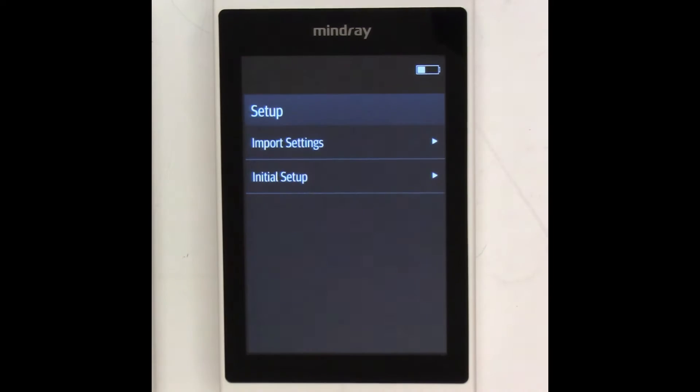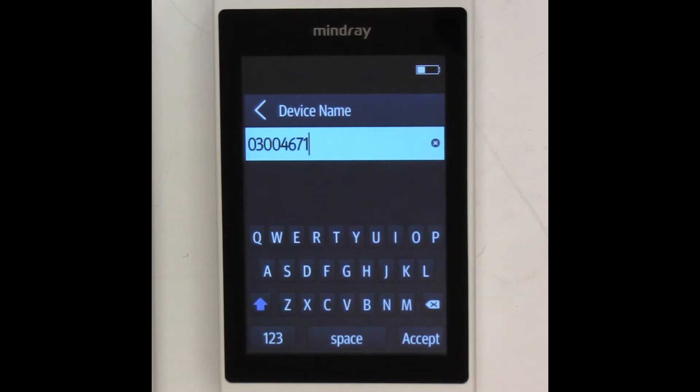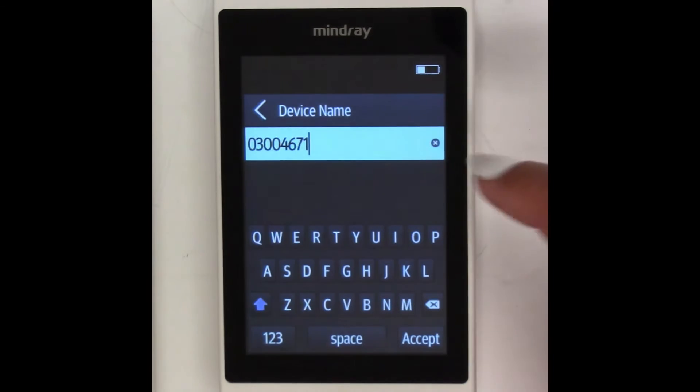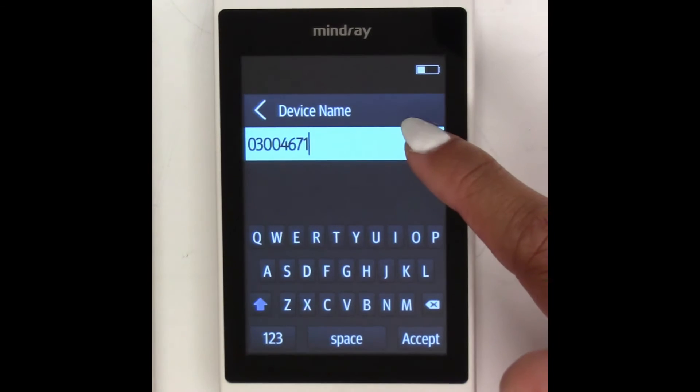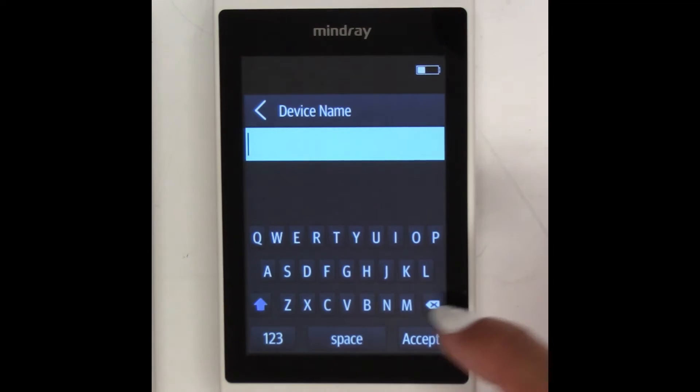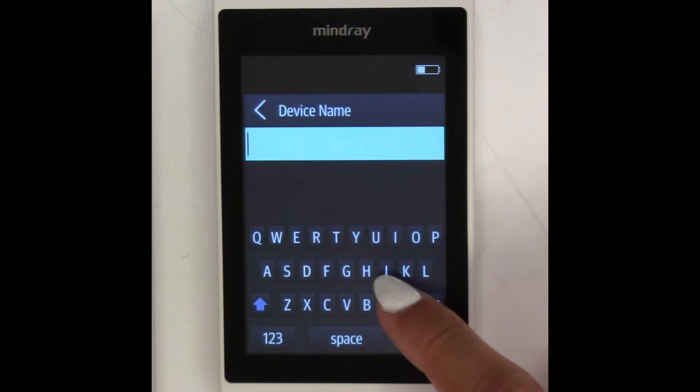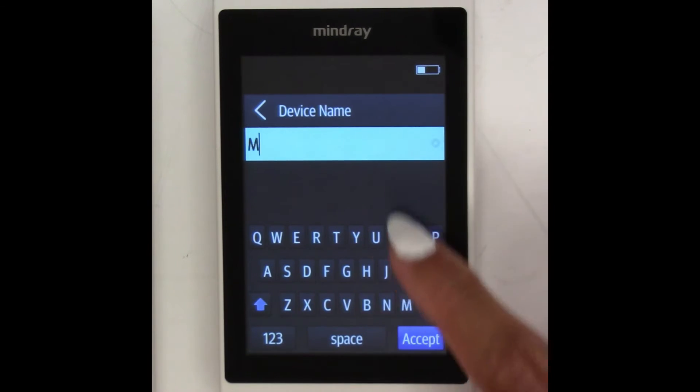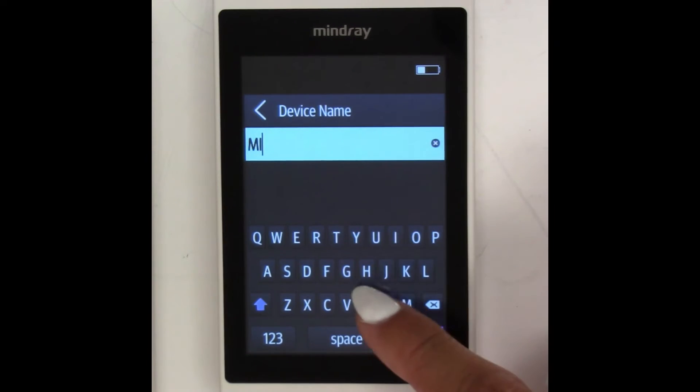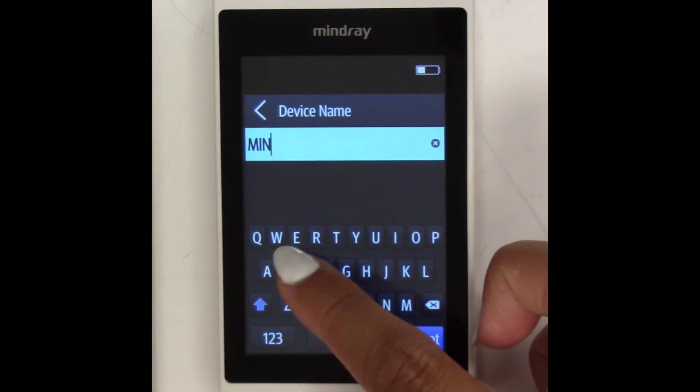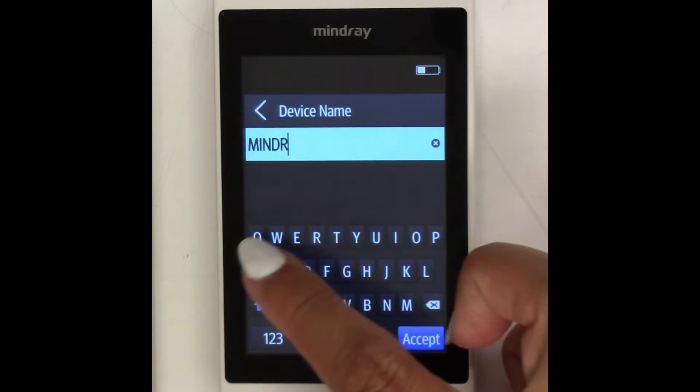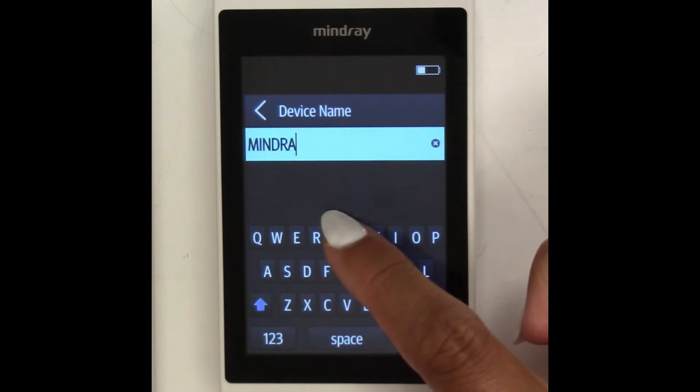In the Device Name field, you can either keep the serial number as the device name or assign a unique identifier to match the sequence of your facility. For this example, we are naming it Mindray. When you're done, select Accept.